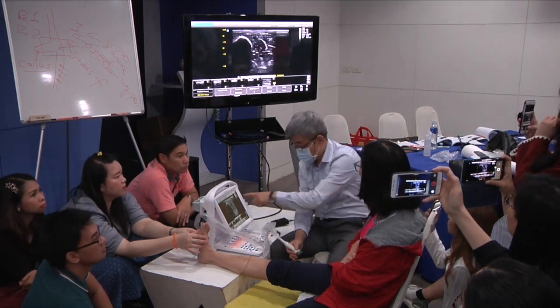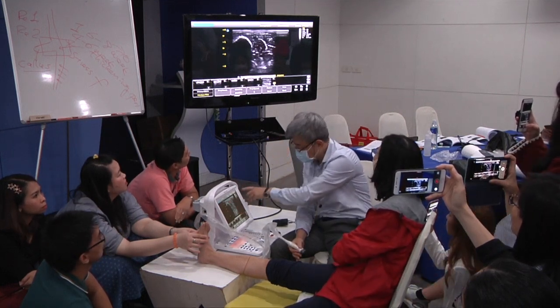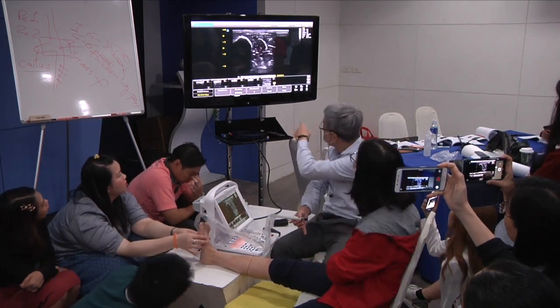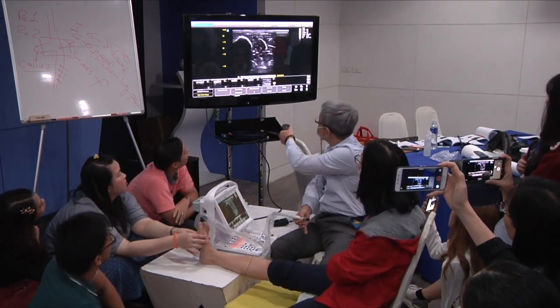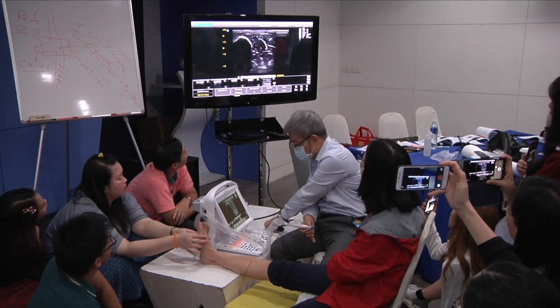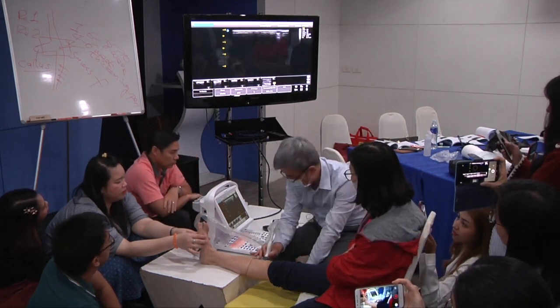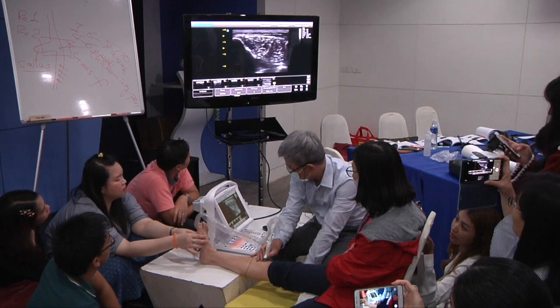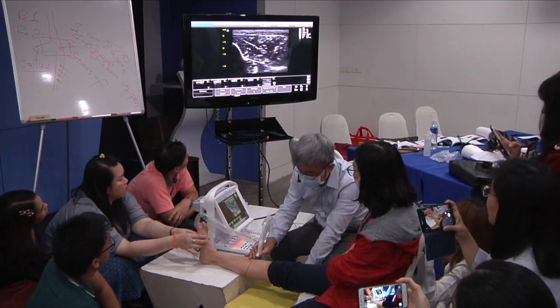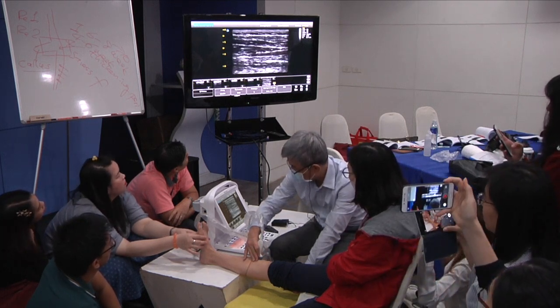Actually, I think the screen is more clear than the TV. The monitor is clear because you can see the margins in here. The TV does not show. There's a margin here. The border of tibialis. Okay, let's go. So again, start from the beginning. You need to find the two-layer structure, turn 90 degrees. Find the penetration and ask her.